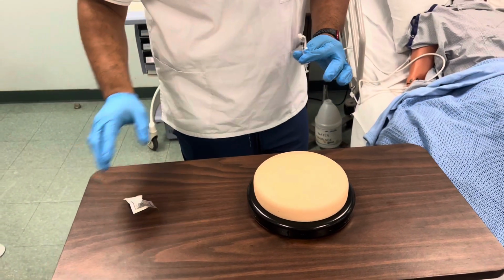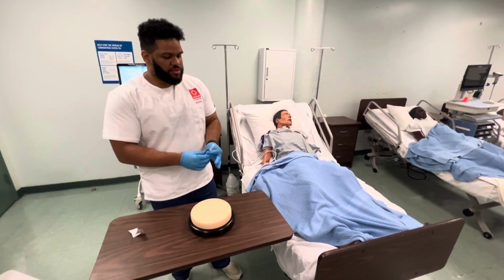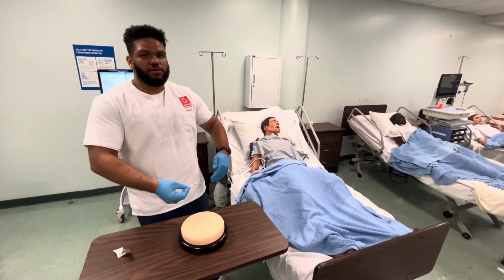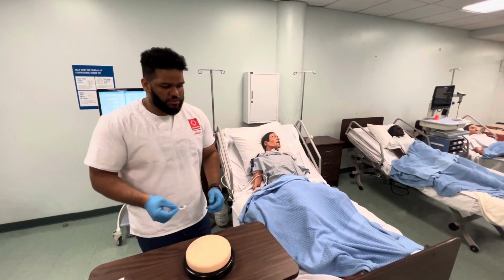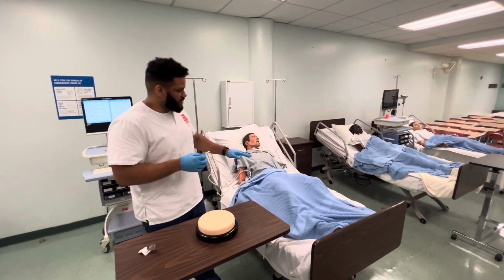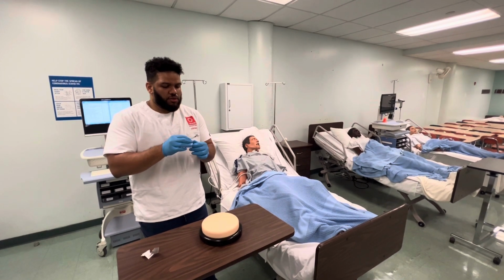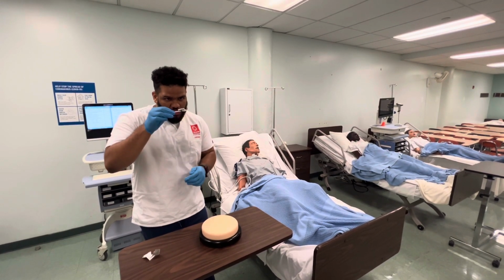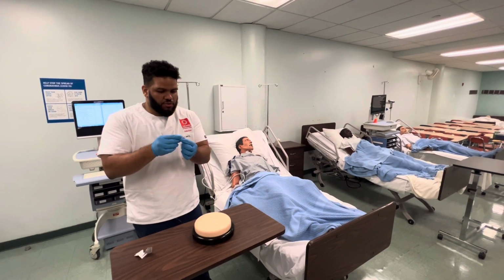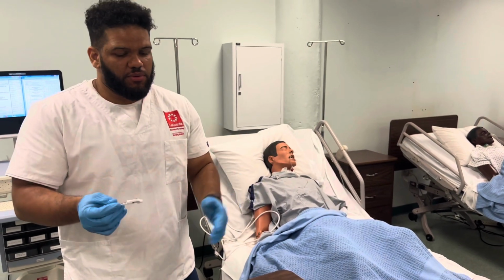And from here, the angle is dependent on the adipose, the amount of fat on the patient. So if the patient is thin, you want to use a 45 degree. If the patient has a lot of adipose tissue, then you want to use a 90. So for this instance, we'll say that the patient is thin, so we're doing a 45 degree angle. And another thing is, for subcutaneous, you need to verify that the bevel is up, where the slant on the syringe is facing towards the ceiling. That's how you know that you have the correct placement of the syringe, okay? For IM, it doesn't matter, but for SubQ, it does.